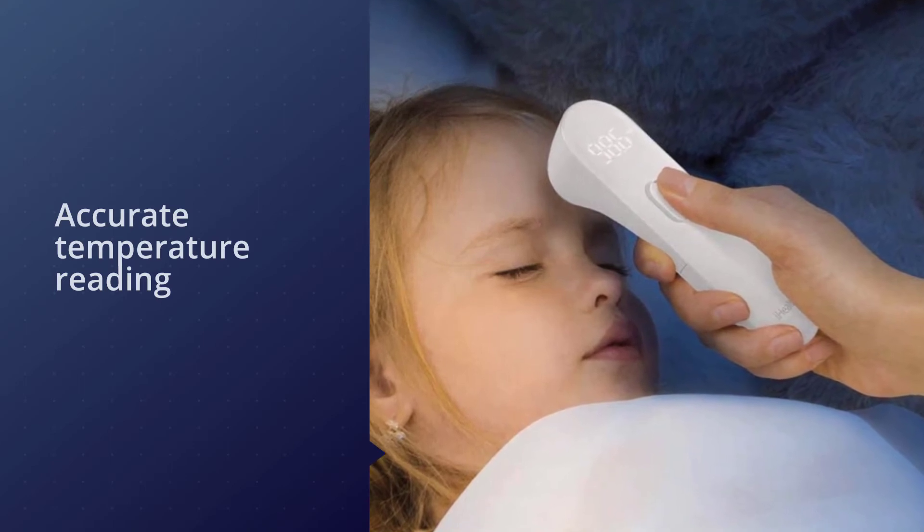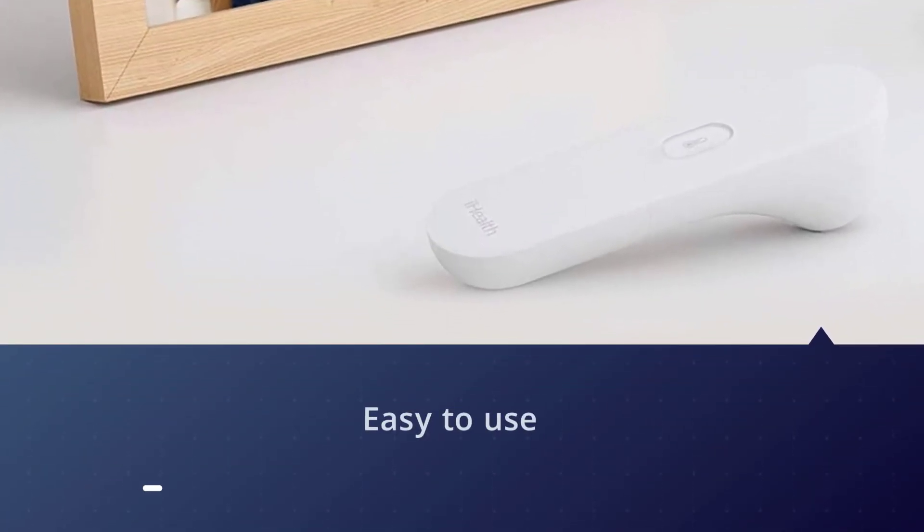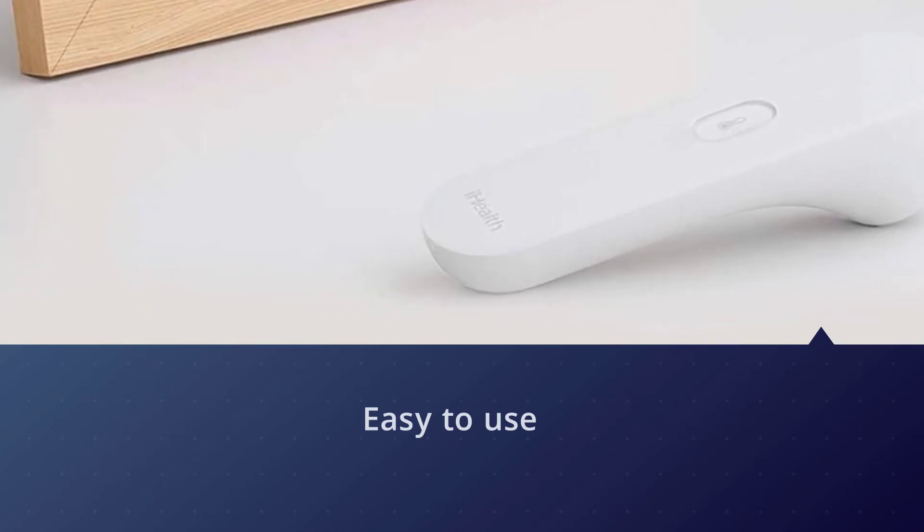Its design is easy to use thanks to streamlined one-button functionality and a bright LED screen with extra-large text. Overall, this is a nice and effective forehead thermometer that you could buy without any hesitation.